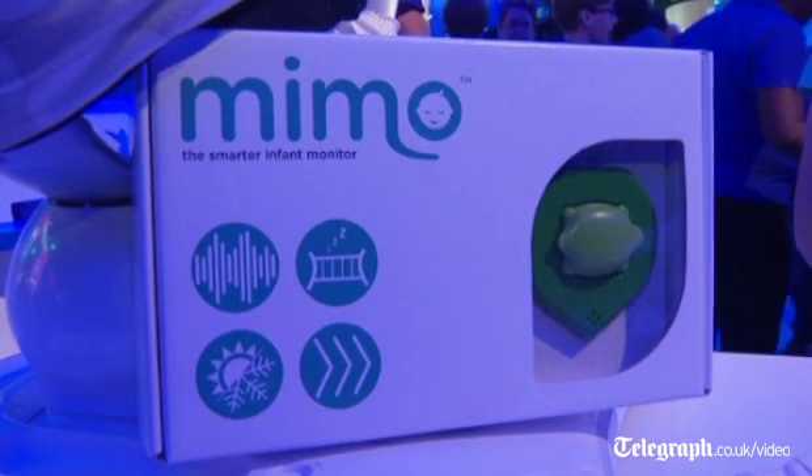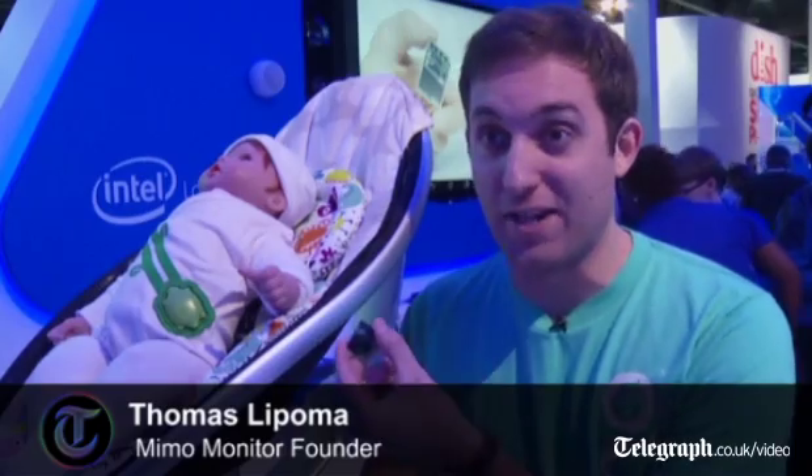We're showing off the new Mimo monitor. We partnered with Intel to use the new Intel Edison chip, which is a really cool new chip — it's essentially a computer built into an SD card.